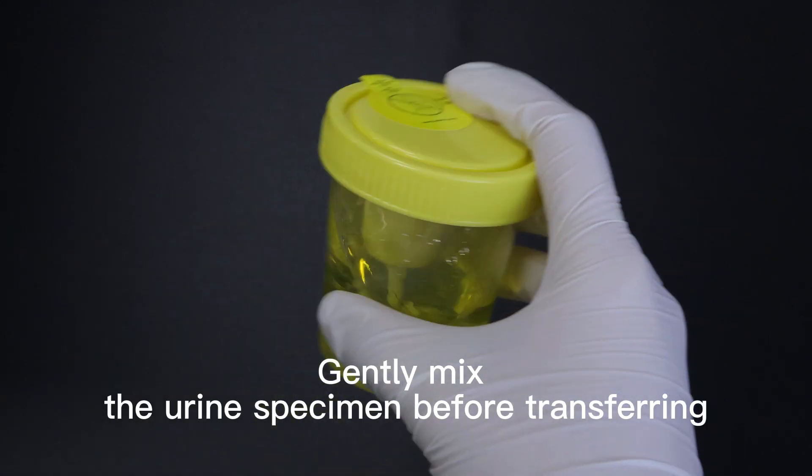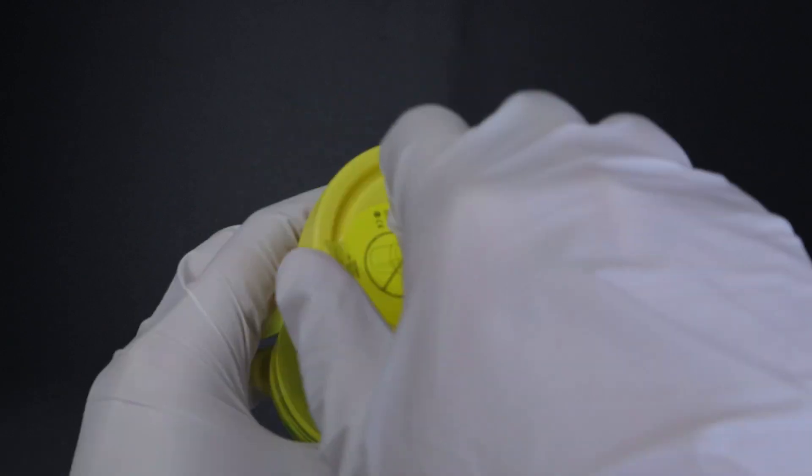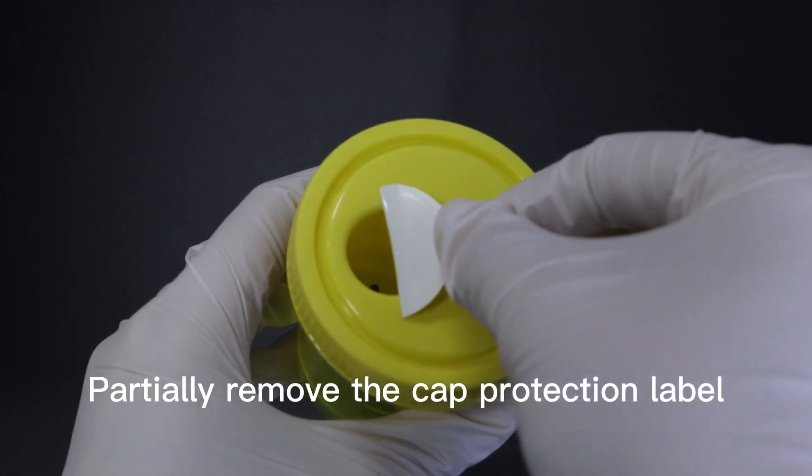The following part is for medical staff. Gently mix the urine specimen before transferring. Partially remove the cap protection label.